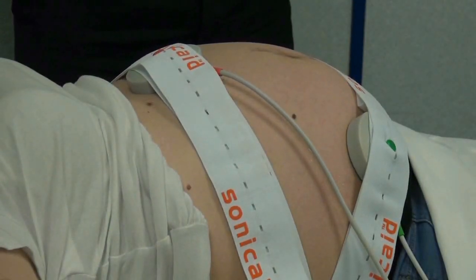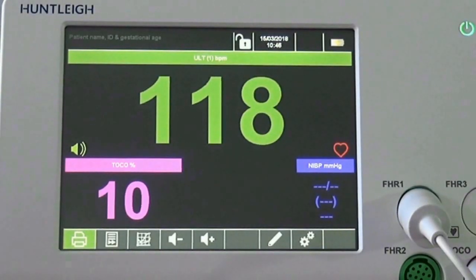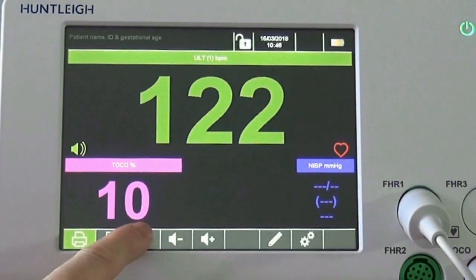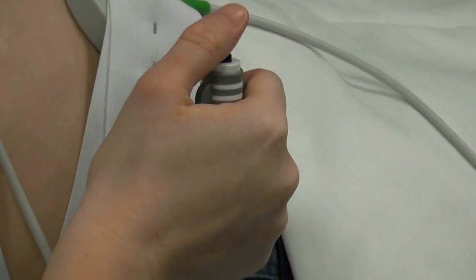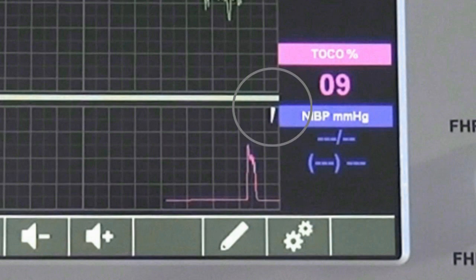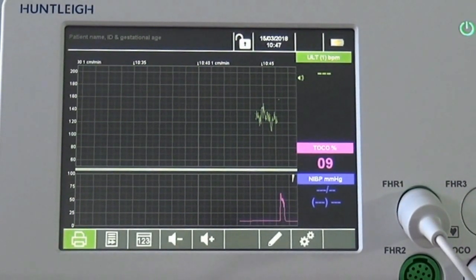With the unit on and the transducers correctly positioned on mum, a fetal heart rate will show on screen. This can be changed to trace view by simply pressing the button as shown. If a fetal movement marker is connected and pressed by mum, a marker appears on screen and on the printed trace. Different style markers are also printed towards the top of the fetal heart rate scale to show movement detected by the automatic fetal movement detector when using ultrasound to monitor the fetus.